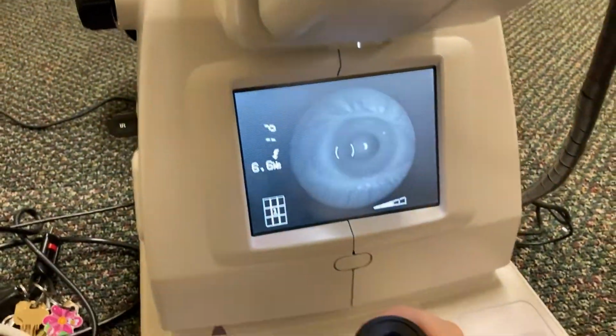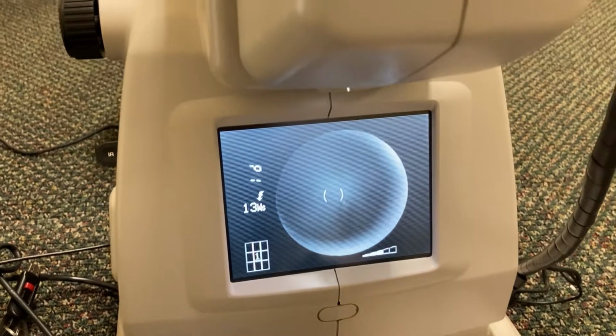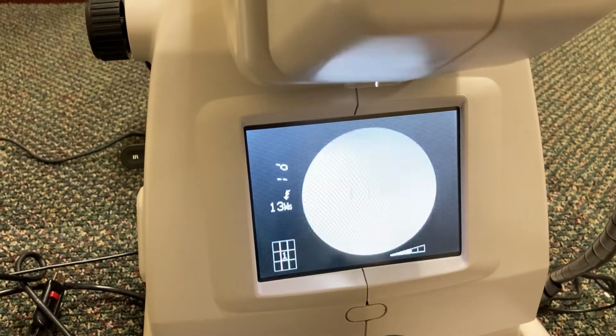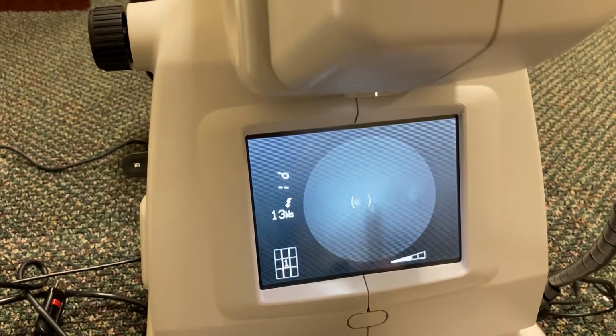So you can see, pulled all the way back, we see their eyeball line up with the pupil, and you go in just enough where you can see those two floaty ghost dots. And as soon as they're touching, that's how close you want to be. Go too far and they'll split the other direction. So I get them right around touching and in the middle, centered there.